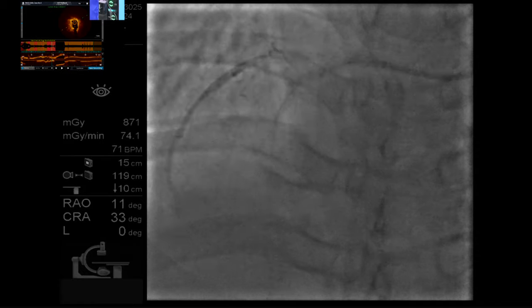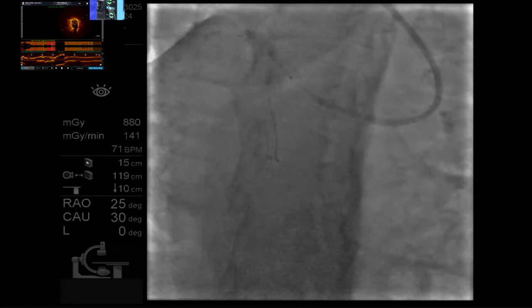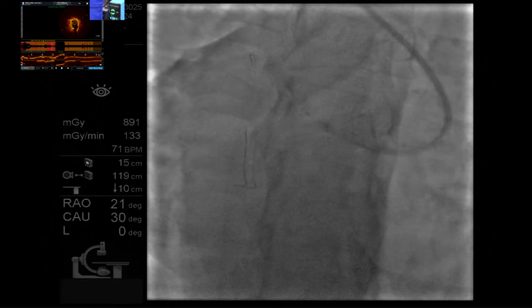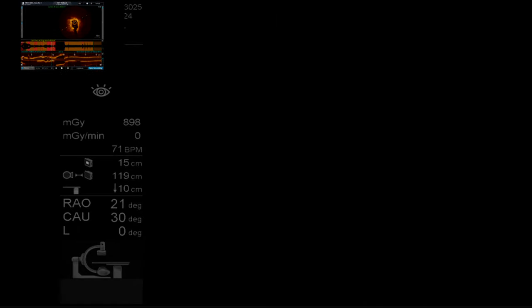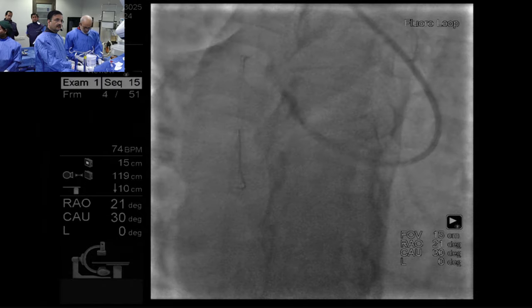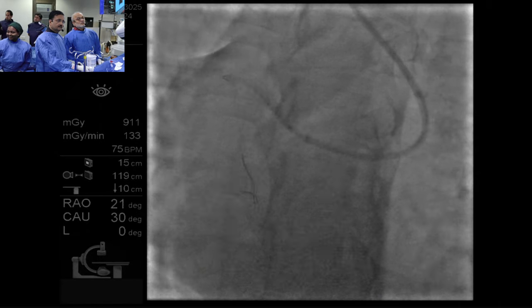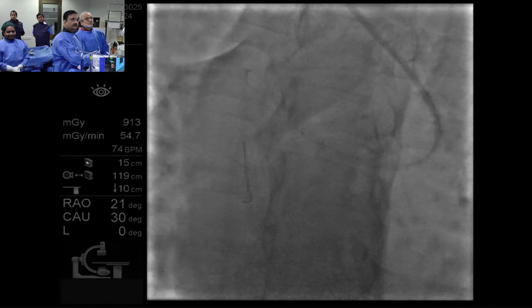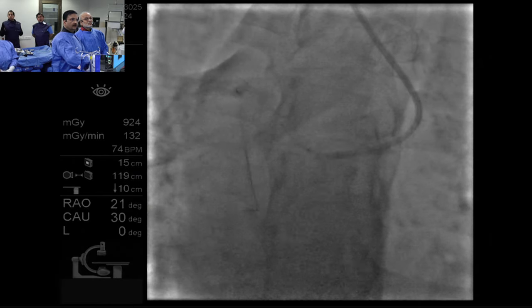It's still based on the distal and proximal reference lumen or EEL. Is it the distal reference EEL or the distal reference lumen? Both is okay, because if you use the lumen, a quarter size bigger, and if you use an EEL, a quarter size smaller. So yeah, same algorithm. Okay. Yeah, that's okay, right. Happy to hear.